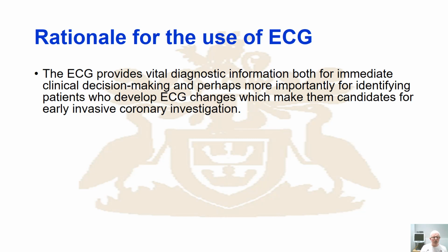This really alludes to the idea that you can identify key pathologies, and you can track somebody's ECG over time. You can look at threshold values, and based upon that you can identify these individuals are probably going to have to go forward for some form of cardiovascular intervention, so some kind of surgery. So that sets out the classic role of the ECG.